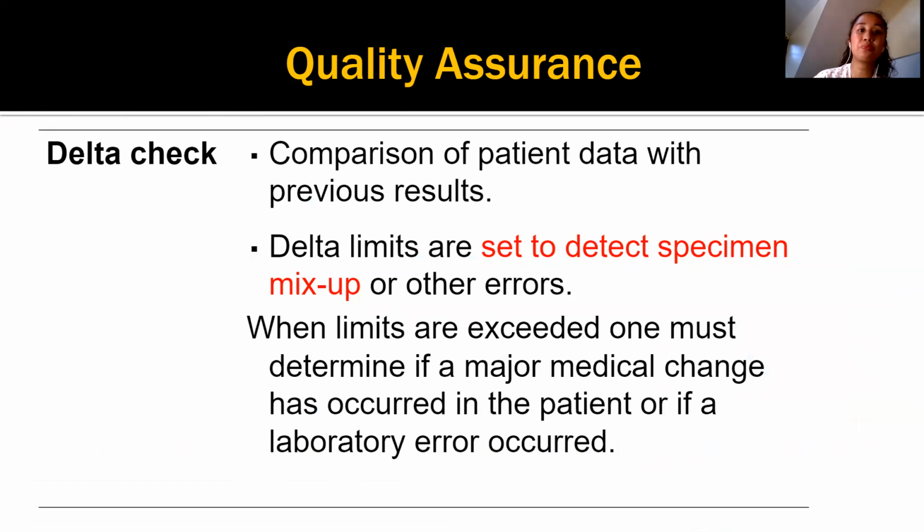So, class, we have this important, very important term in medical technology. We have delta check. Yan. Ginagawa natin to every time before releasing results, we perform delta check. What is delta check? We compare the current results to the previous results of the patient. So, kung ngayong February 28, nagpa-check si patient Brian sa laboratory natin, suki natin to. So, last month, nagpa-check rin siya. So, tingnan natin, i-compare natin yung glucose results niya ng last month. Yan. Because yan, it's very important.